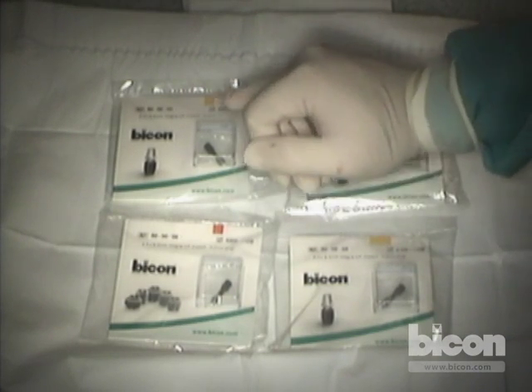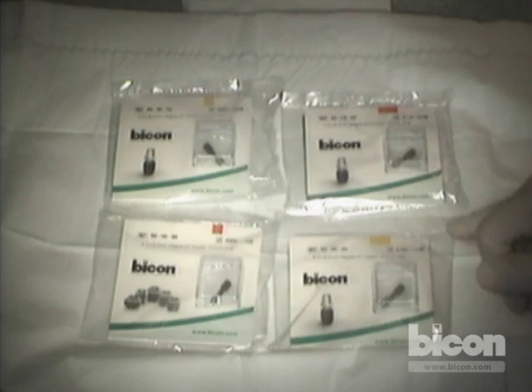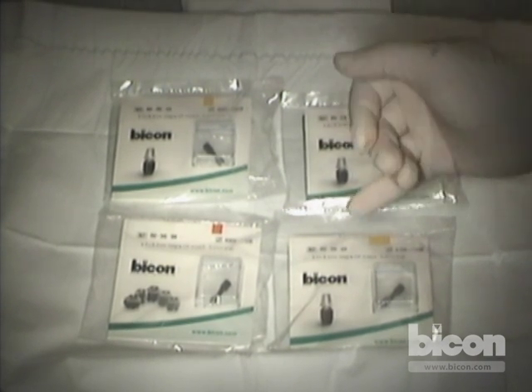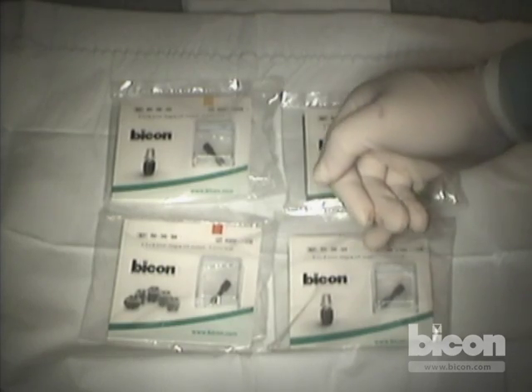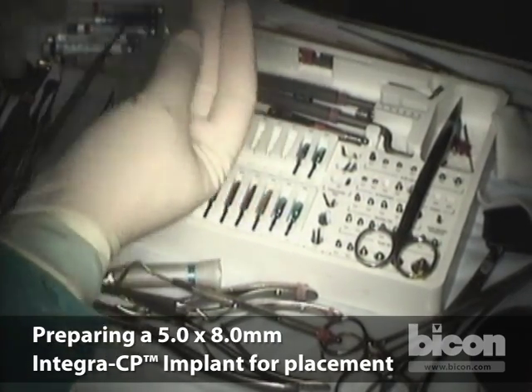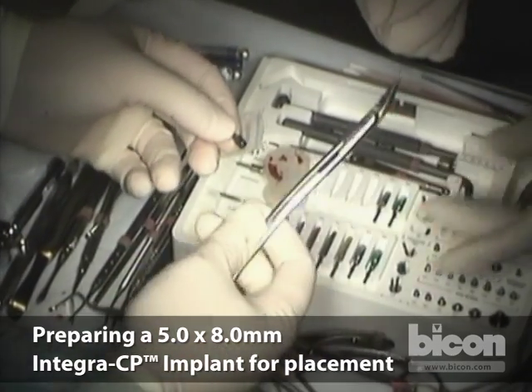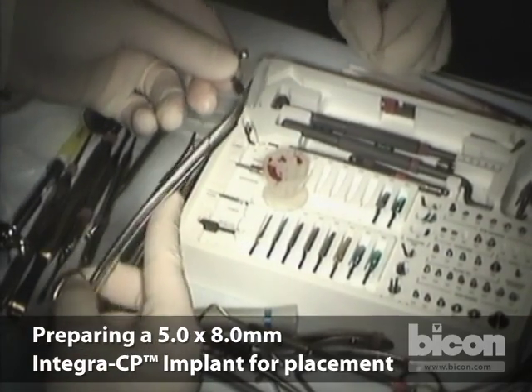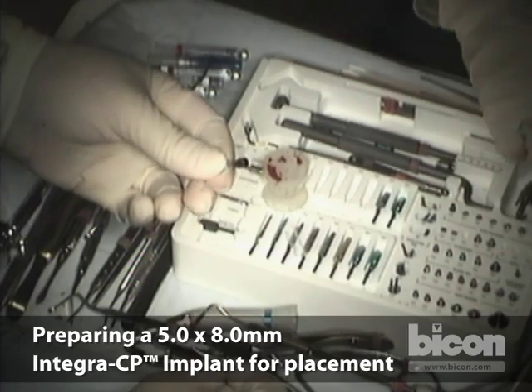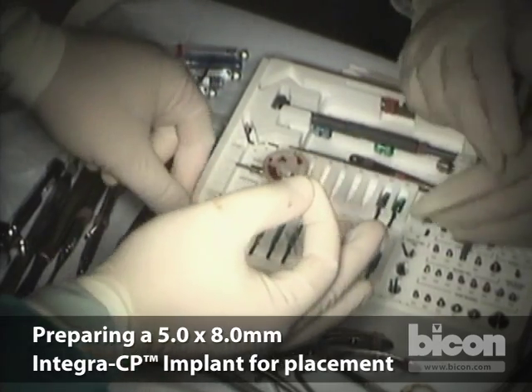We could place a five by six since the osteotomy is the same, but that may place the implant a little too deep to obliterate the whole socket. So we will choose the five by eight millimeter short implant. The implant is packed sterilely — the white paper and blister pack are sterile, and inside is another sterile bag containing the actual implant. The implant should never be manipulated except through the plastic bag or when it touches the bone in the recipient site. We cut the plastic bag and handle the implant with the plug and carrier that comes with it.